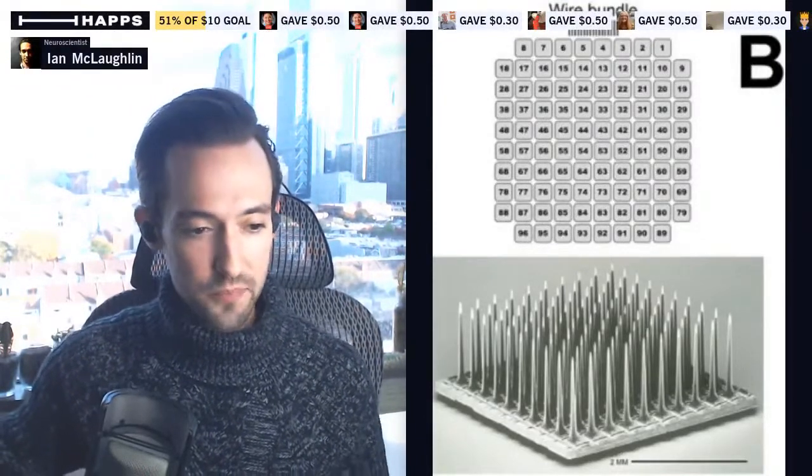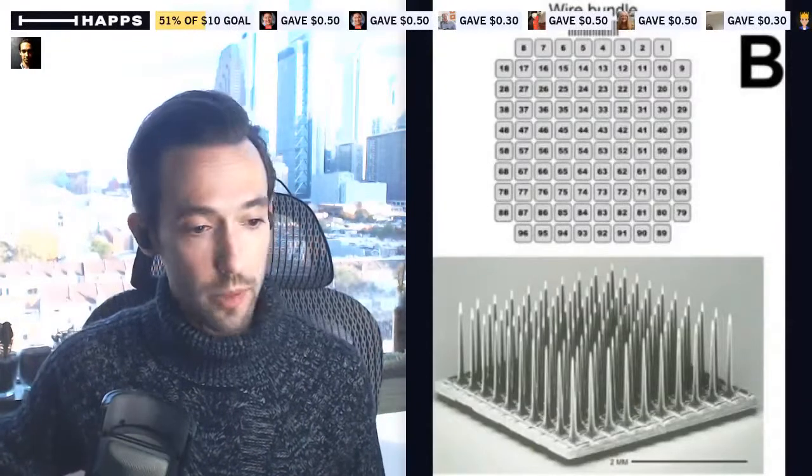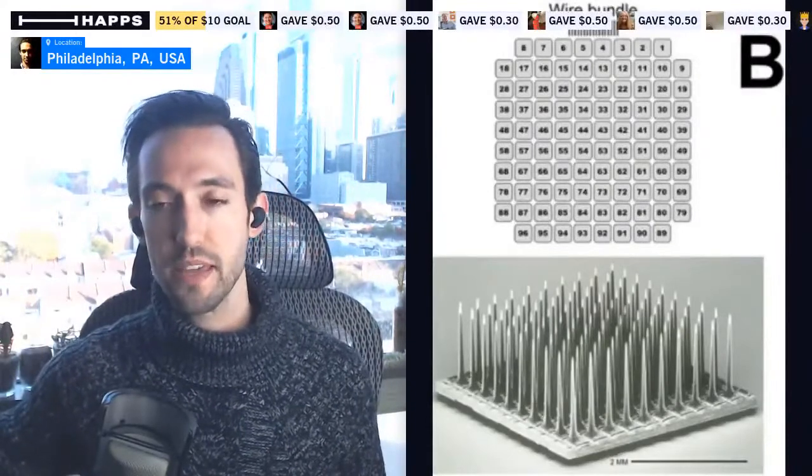And so Fernandez, okay, and sorry, so it's tiny. Yeah, it's tiny. And so Daryl says, I imagine even the most trivial visual signals would be hugely beneficial to somebody who's completely blind. Absolutely. Yeah, exactly. The group describes this as being sort of like a 10 by 10 pixel kind of visual experience, which is pretty minuscule. Depending on where this video is landing right now, this is about a 1,280 by 720, right? So 10 by 10 is pretty minuscule. But again, that's just one of these teeny tiny little implants. And so imagine 5,000 of them. All of a sudden, you're starting to get some real resolution. You could perhaps discriminate even more complex and nuanced visual fields.